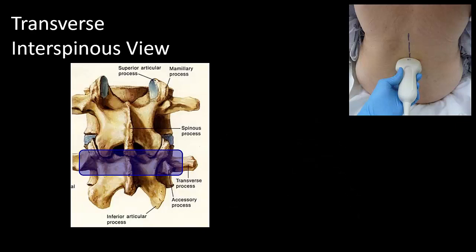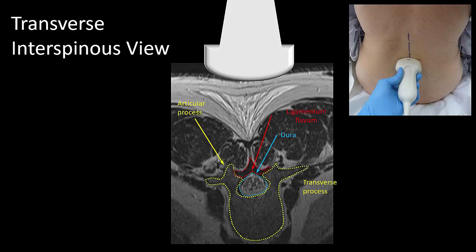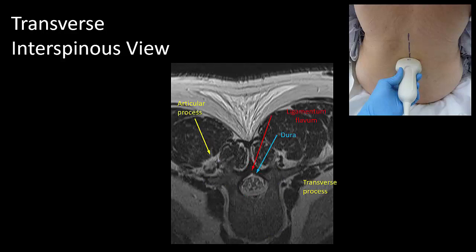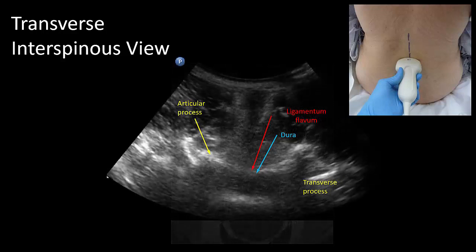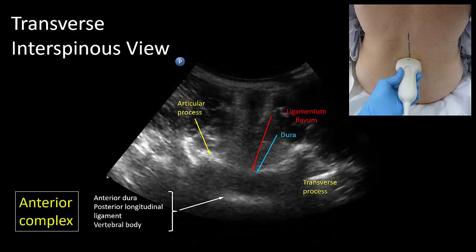Shifting the probe cranially or caudally will bring the beam into the interlaminar space, where there is now no bone between the probe and the vertebral canal, so we will see the anterior complex appear and sometimes, but not always, the posterior complex. In this plane, we will also see the articular process and transverse process shadows.